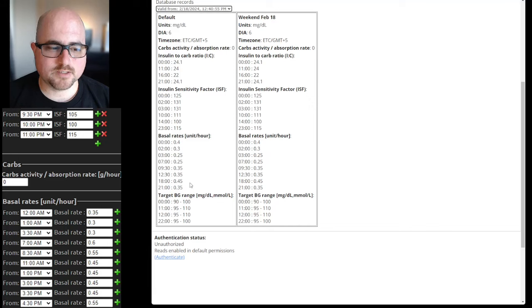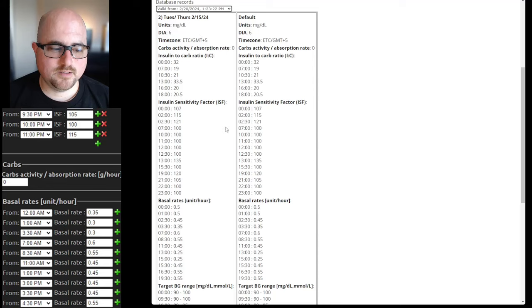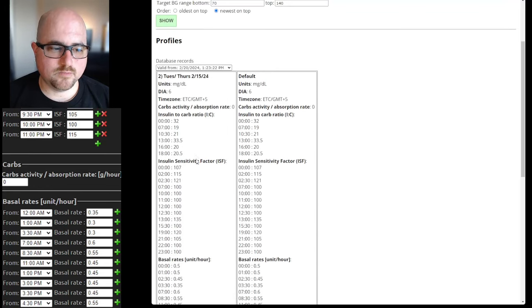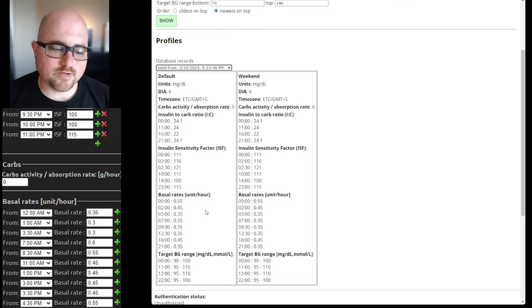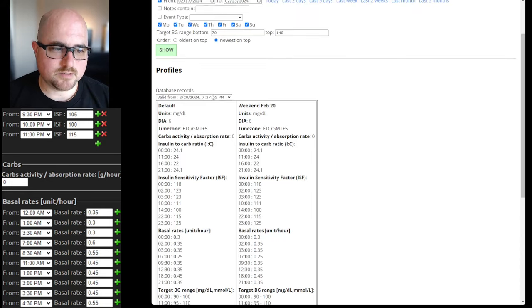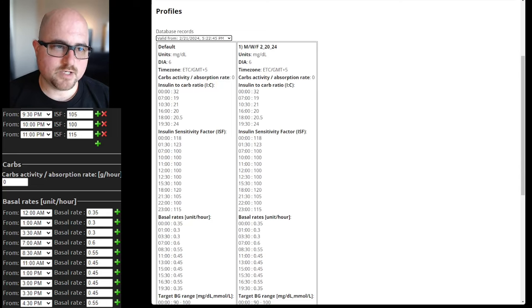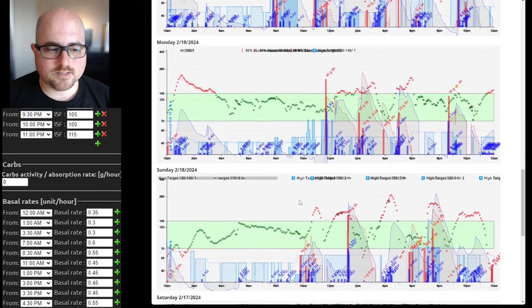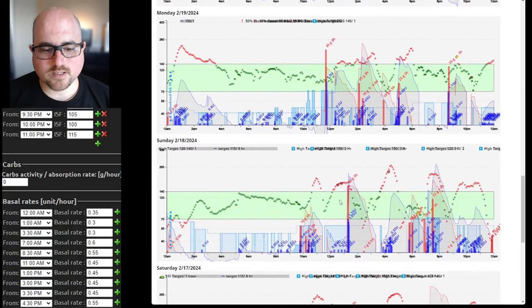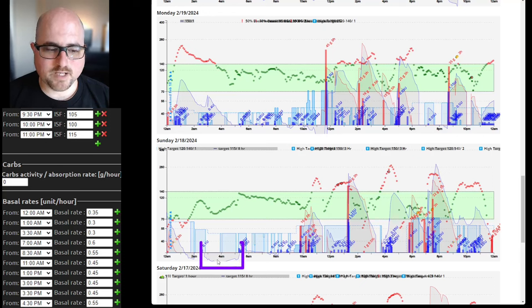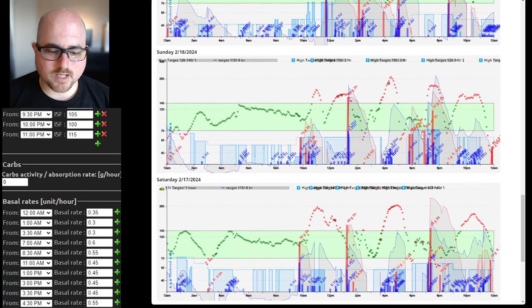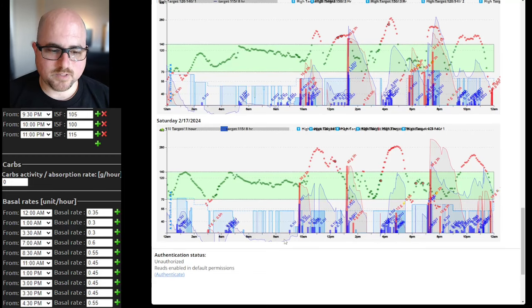The 17th and 18th are the home basal rates. Going back even further — yeah, that's the weekend — I think you were hovering right around pretty good basal rates before, in that 0.35 to 0.4 range. I just want to make sure we figure out where the big changes are. Around the 20th and 21st is where you get a change. Popping back over to the day-to-day, you can see like the 19th and 18th are still kind of spiky, but carb ratios are probably a little bit weak in general. You got some negative insulin on board on Sunday, and a little bit on Monday morning with some crashing. Basal rates are probably a little high, and you have a higher target on Saturday — when you have a low there with higher basal rates on the left, it looks like you're kind of flipping back and forth, using basal to address the challenges with meals.